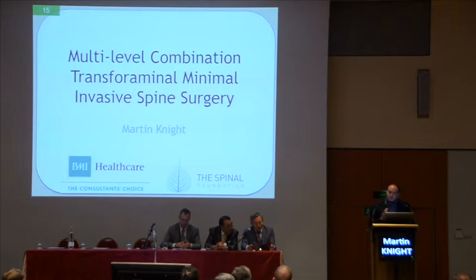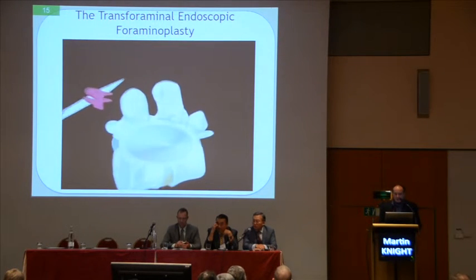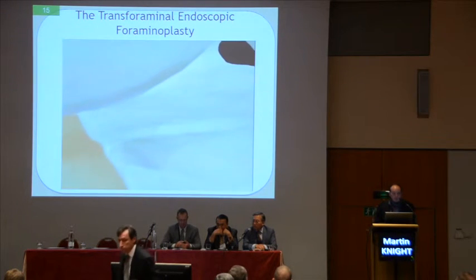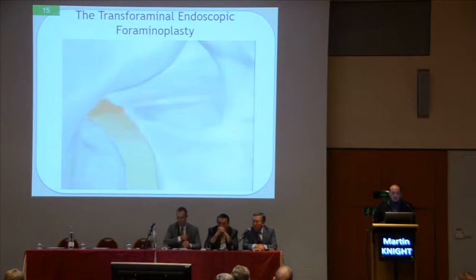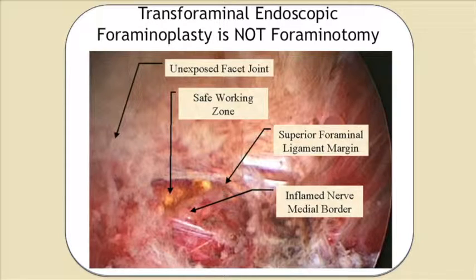I'd like to go from what you just heard so clearly explained by Michael Schubert to a further evolution, and that is multi-level transforaminal endoscopic spine surgery. As you've seen, we pass down through the foramen, and you'd expect to see a nice, clear working zone when you get there. And of course, if you're just going for endoscopic discectomy, you won't really see this area. You'll be going straight into the disc. But in fact, most times, you're faced with this.